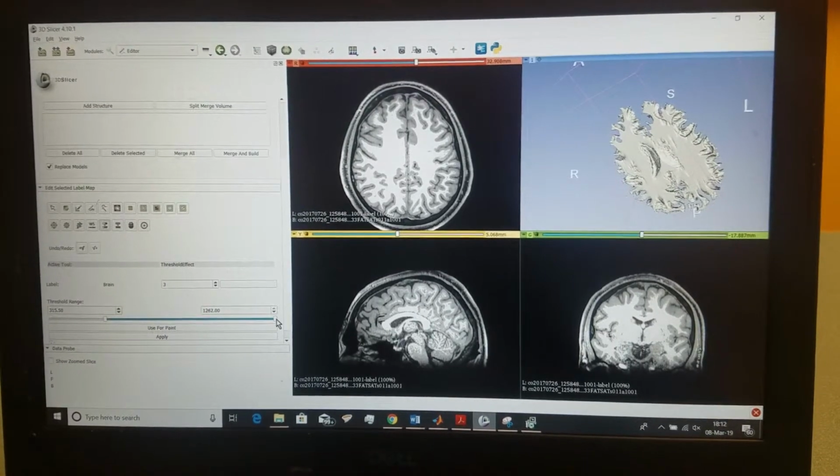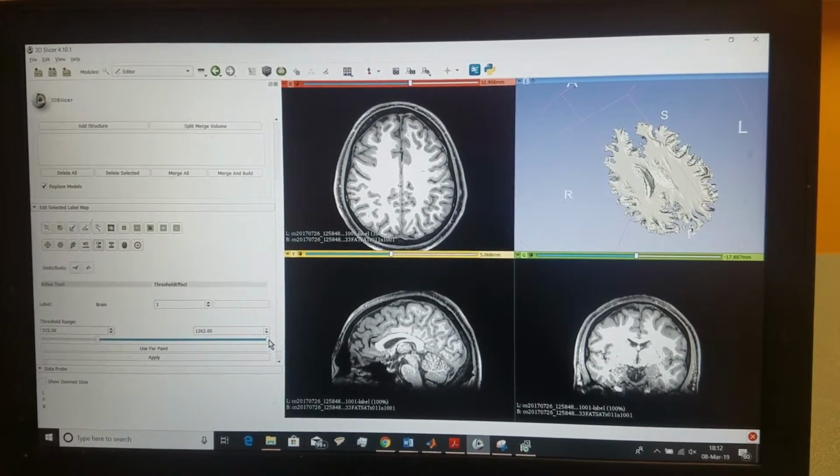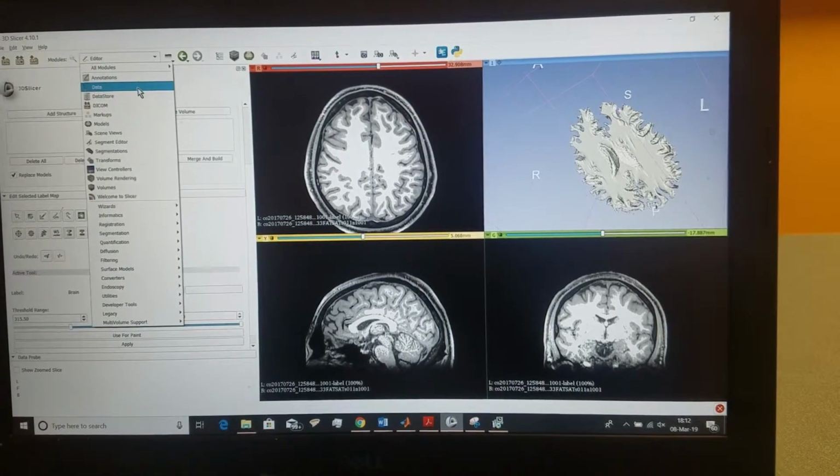I'm going to be showing the assignment 2 presentation here for medical robotics. So the first step was to use 3D Slicer to do segmentation.